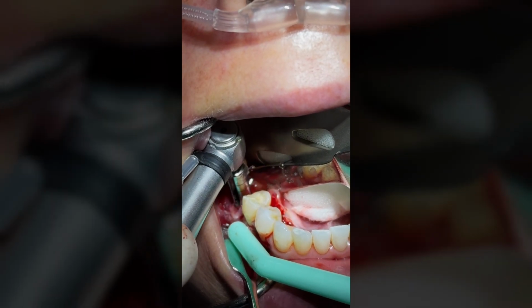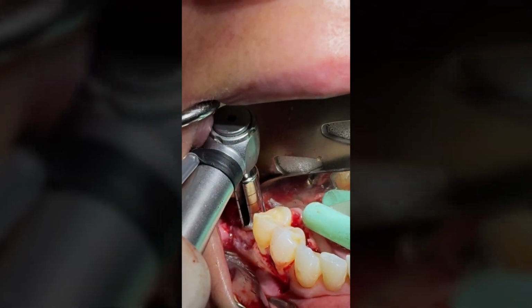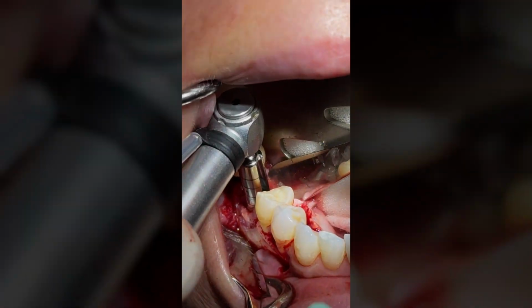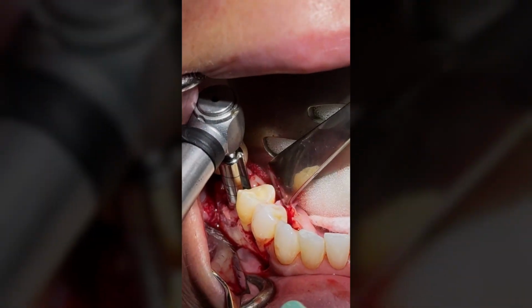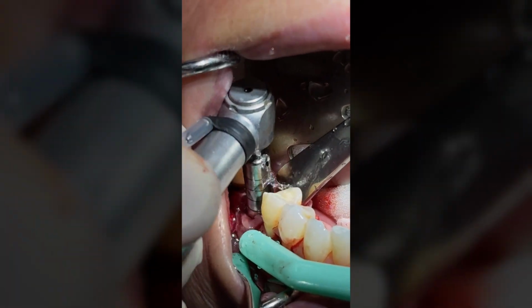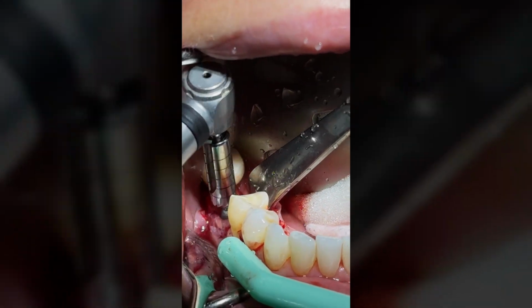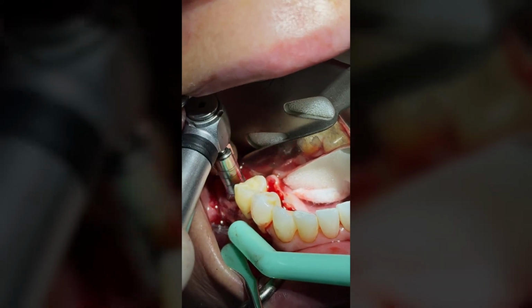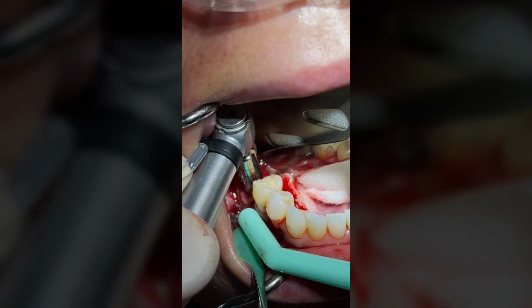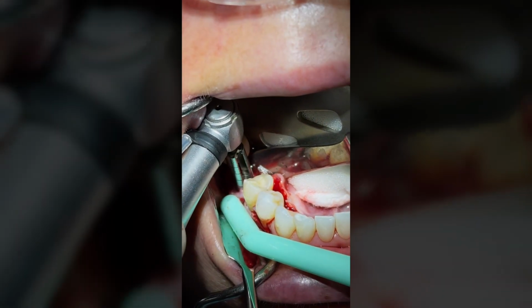It's very, very important that you go all the way to the last thread. We usually leave about 1 millimeter of bone around the last thread as a safety margin. We're not going to go past that because of the nerve. As you can see, the trephine has a window on it, so you see the depth. Every laser mark on it is about 3 millimeters. I'm guessing this implant is about 10 millimeters, so if I go all the way to the third one, I'm almost there.